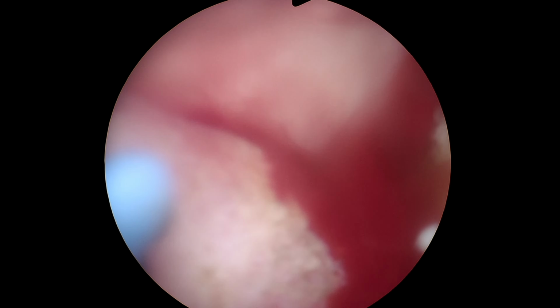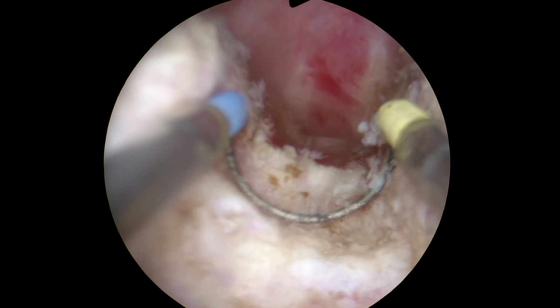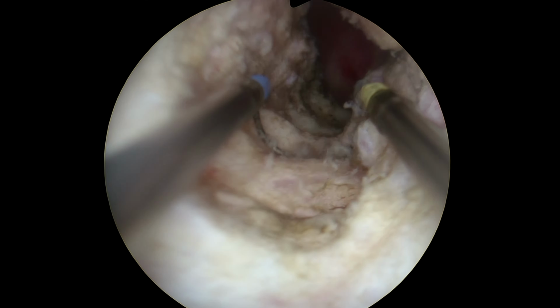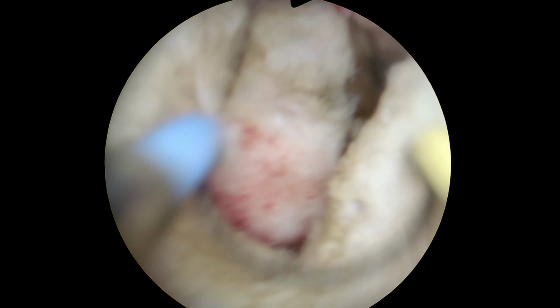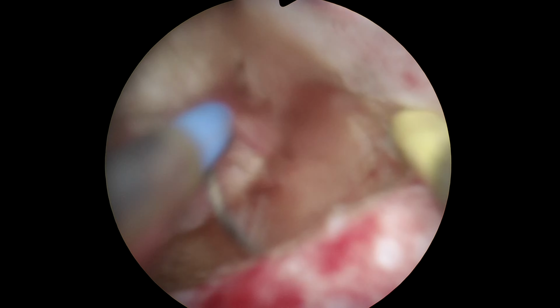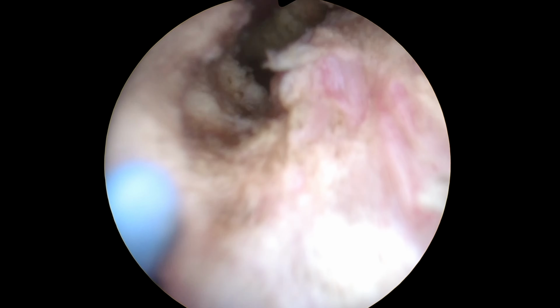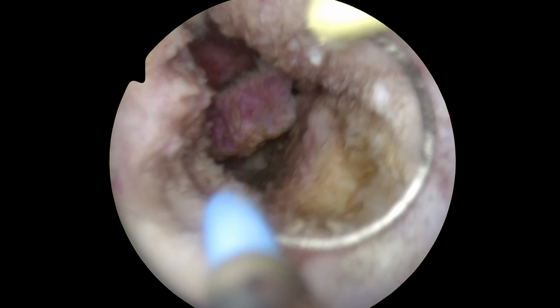Bleeding during resection is quite normal, but it's very important to follow the rule: coagulate, because having lost the exact localization of the vessel, you may then spend time to find it. The number of vessels that bleed during resection increases the closer we get to the pedicle of the myoma.